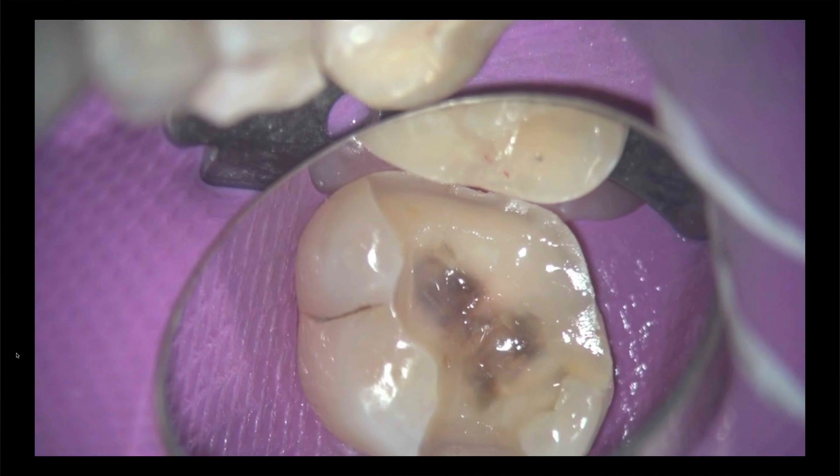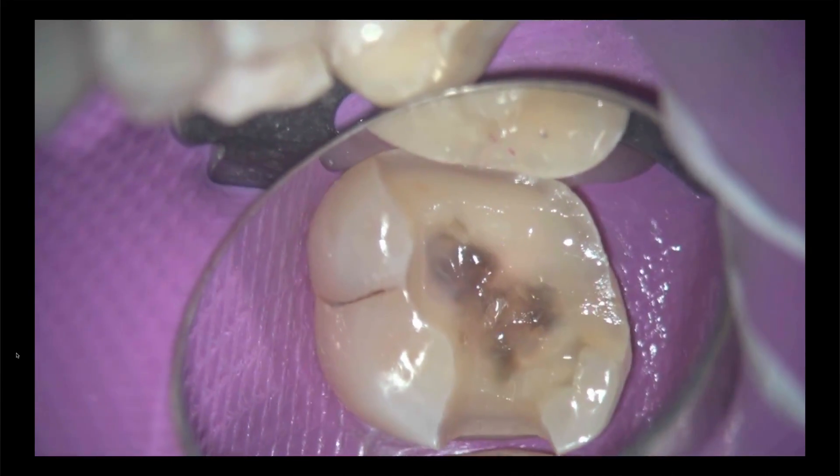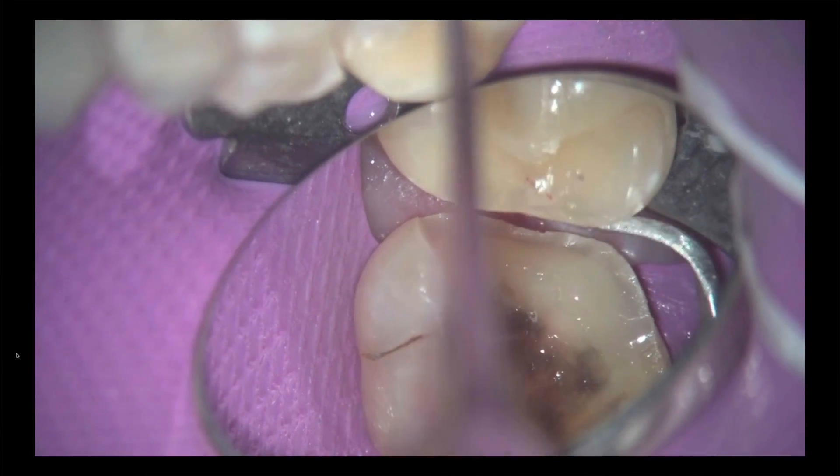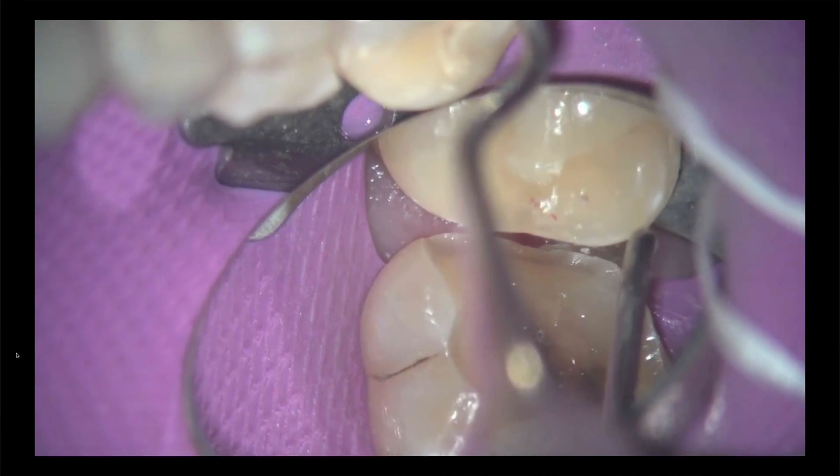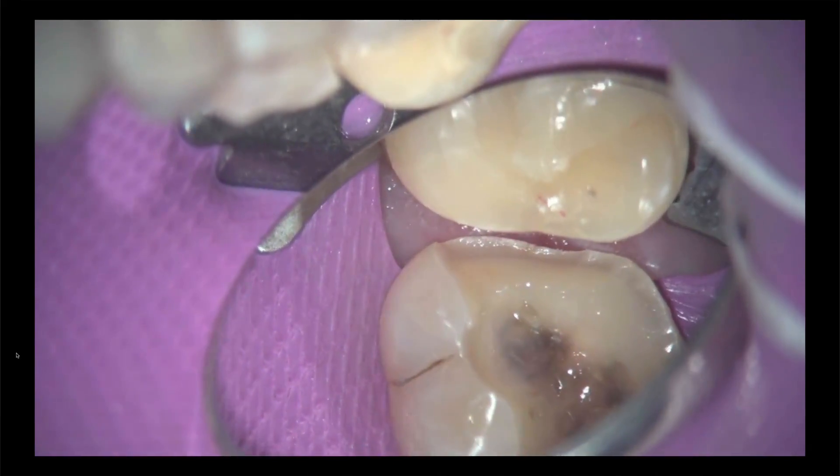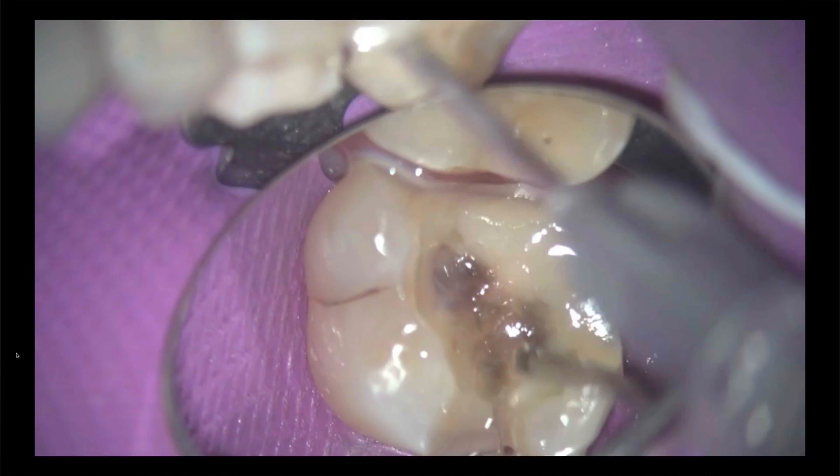So here is after I finished the preparation. There's one little area I wanted to smooth still, which you'll see me do. But if you look here, we have good draw, we have perfect box forms. There's that little spot. I just want to smooth that. I'll use my scaler for that. Again, an enamel chisel could be used as well. But if you look inside the preparation here, it's actually really shiny. It's shiny there. And if you notice, I put something over top of it that was glycerin. What we did in this case and what I do in most of my onlay preparations is I did an immediate dentin sealer stage or step where I sealed the inside dentin of the preparation with the immediate dentin sealer technique. And I used a little bit of flowable plus the Octobond FL filled adhesive to fill in any undercuts. There were two undercuts, one on the palatal wall and one on that remaining mesial buckle cusp that I left.